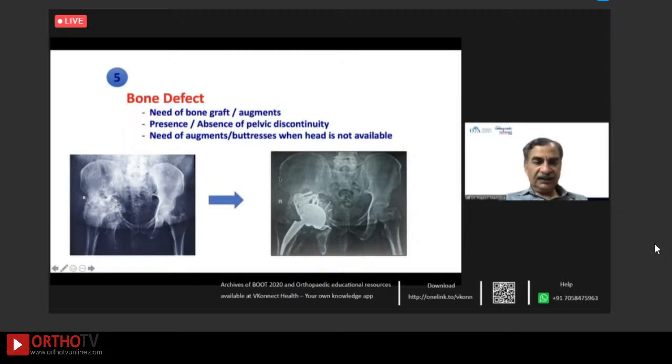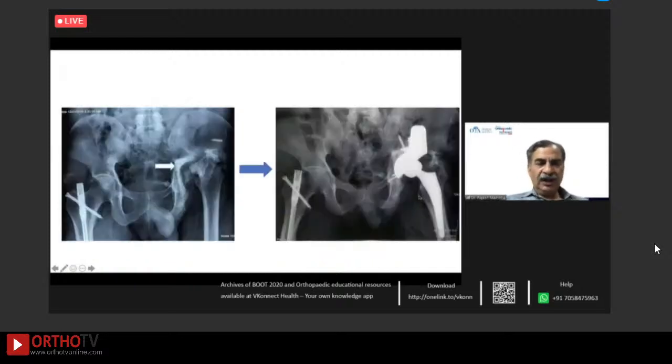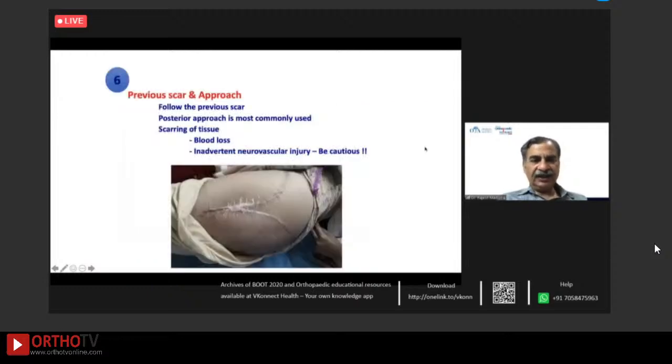So this is an example which had a pelvic discontinuity and it needed the special technique I'm going to talk more about. And if you don't have a femoral head, you will need to put these buttresses to take care of the bone loss. So you have to be prepared all the time.